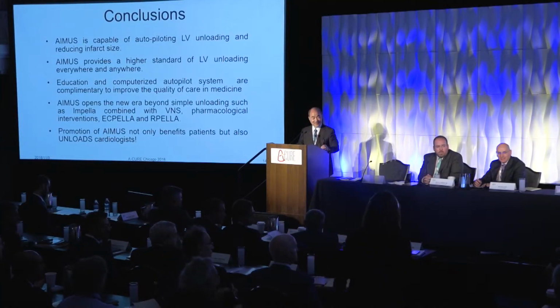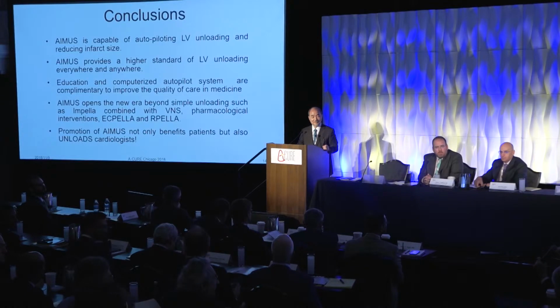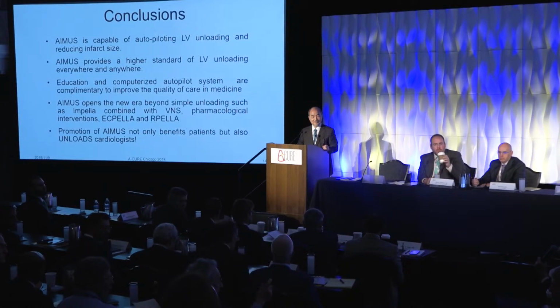Yeah, I think I understand the question or the comment, but I think that you're ignoring what Kenji kind of got to the bottom line, which is that what you're saying is not possible with a linear end systolic pressure volume relationship. So when you're in this range of partial support, as you increase from low to high speed, what you're doing is transferring the flow from the heart to the device, and the ventricular pressure is really not changing very much until you get to the point where the aortic valve closes. And then at that point, as you increase speed, now you're working on the descending limb of the pressure volume relationship. So I think that's the point, but I think the way you set up the question is not physiologically possible.